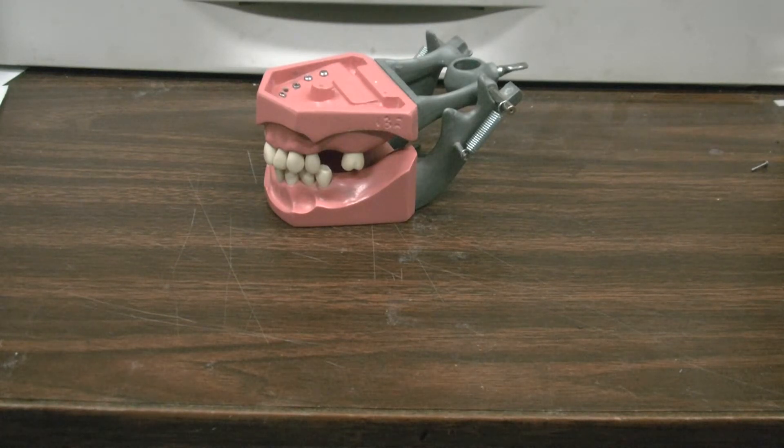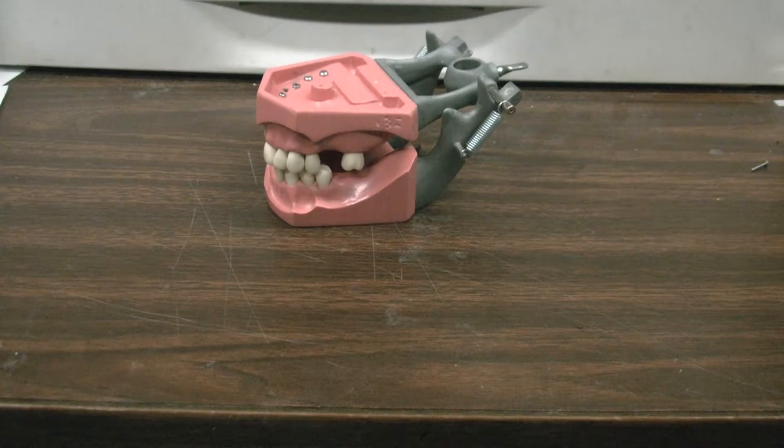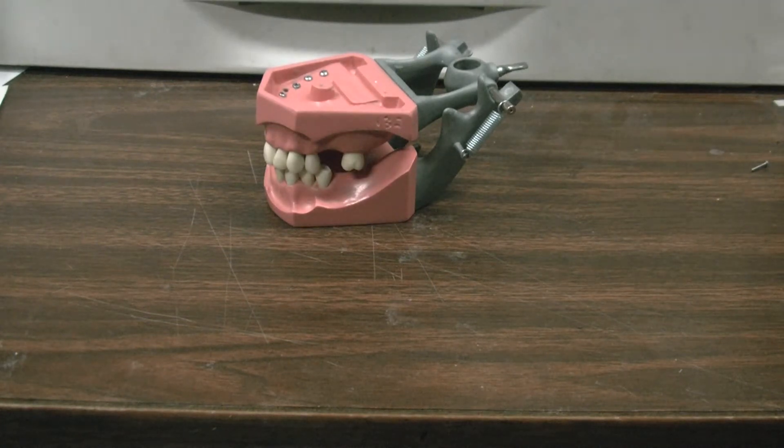So now, Roger refuses to demonstrate this, so I guess I have to do it. This is the Roger method of screwing a tooth into the removable typodon.